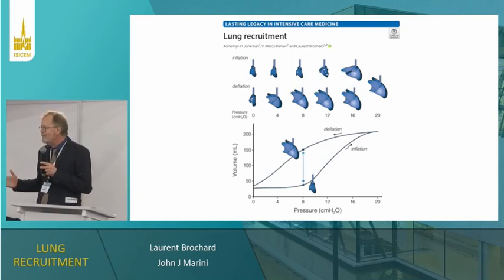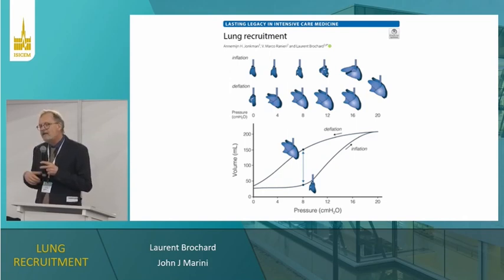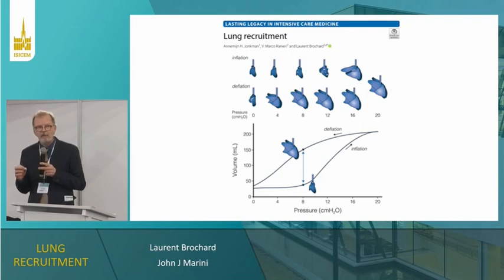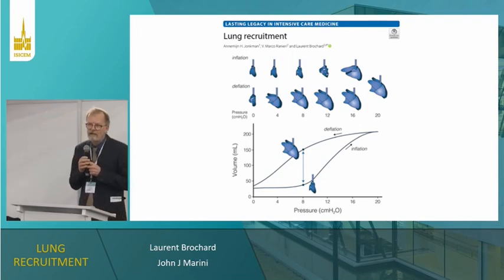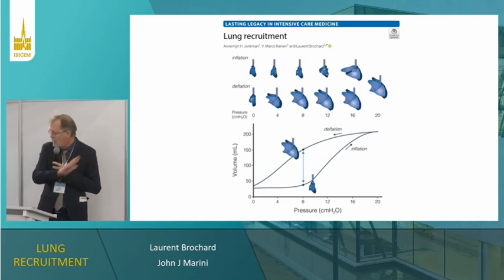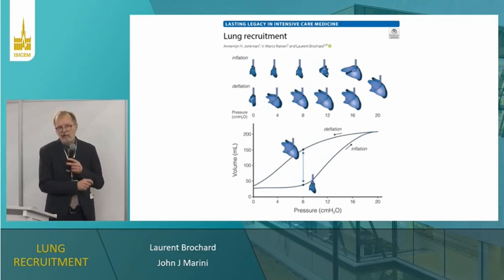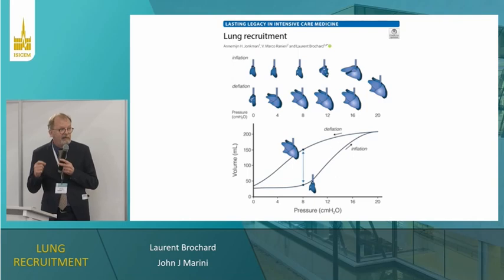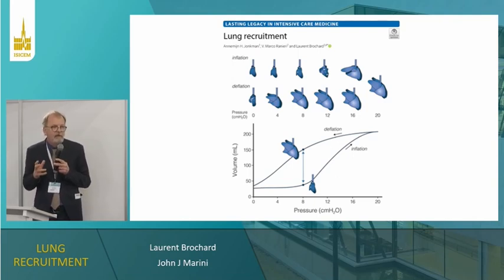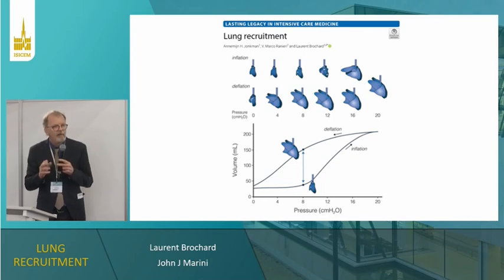Okay. Most critical care patients in your ICU, intubated, sedated, do you need PEEP? I think yes, in any patient, for two reasons. One is that in anesthesia, you take normal patients without any lung disease, you put them under sedation, paralysis, you lose 20 to 30% of lung volume, right? And we do that in all our patients. So I think you need some PEEP to counteract that. I'm not saying very high PEEP, but some level of PEEP.